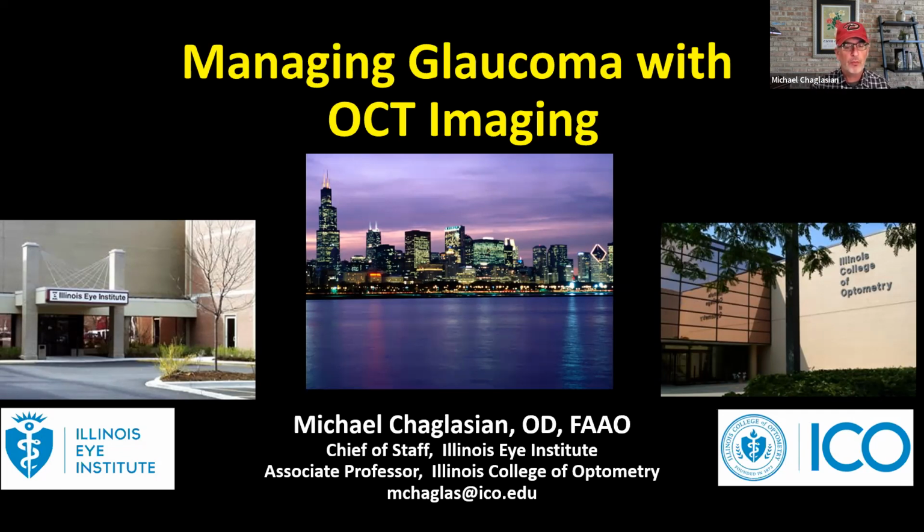I talked, of course, about a lot of glaucoma stuff because that's what I live and breathe. We didn't really get to spend enough time on OCT imaging and the use of OCT in managing glaucoma patients. So you were kind enough to invite me back here. I put together a new lecture and look forward to an engaging evening with everyone as we take a deeper dive into the use of the OCT in managing our glaucoma patients.